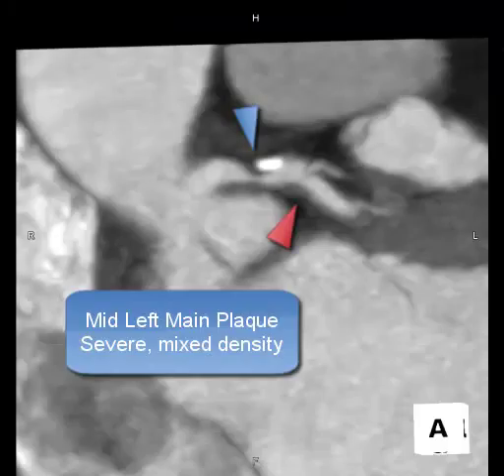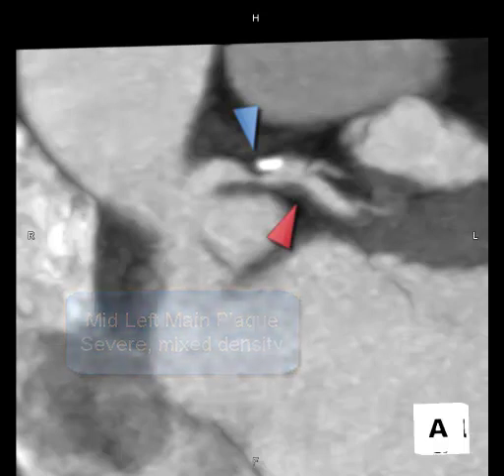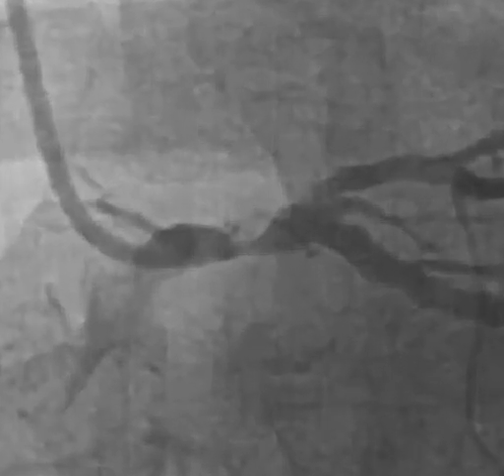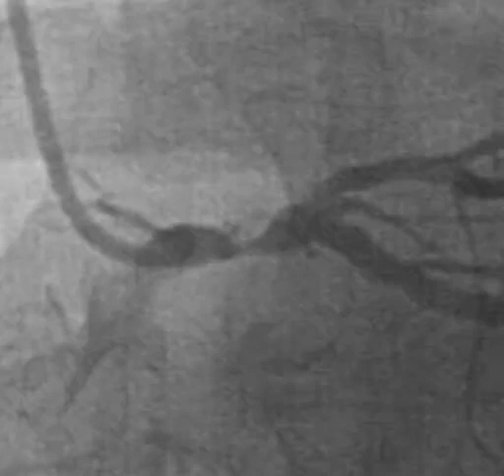In summary, the small blue arrowhead indicates the mid-left main plaque, which appears to be of severe and likely obstructive severity. The small red arrowhead corresponds to an area of soft plaque in the left circumflex. Here we have a direct heart catheterization showing the same rendering orientation of this severe left main stenosis for confirmation.